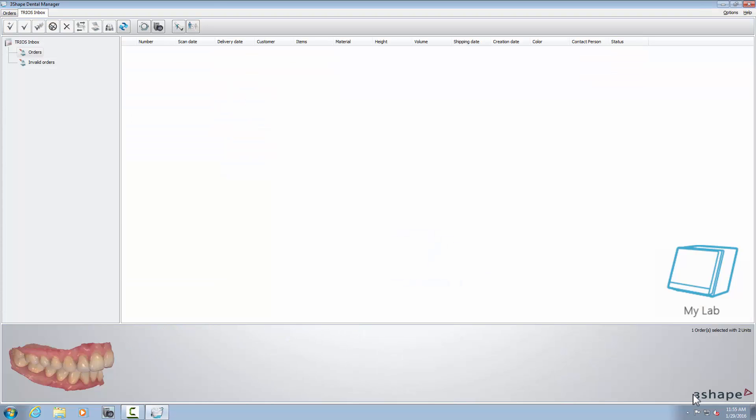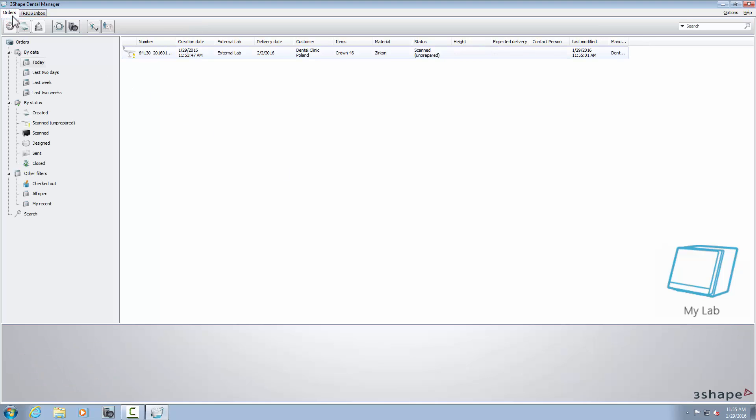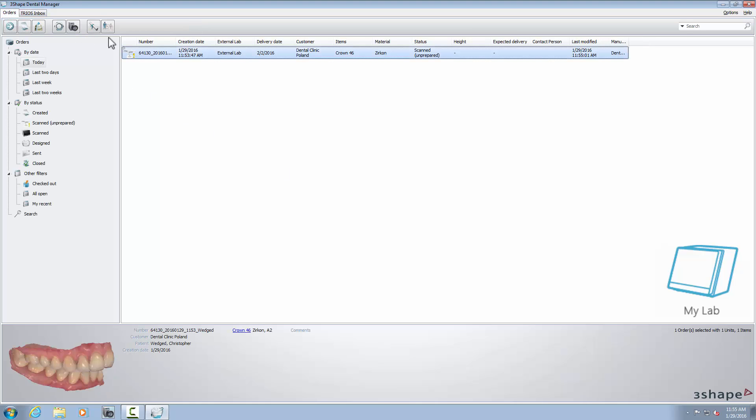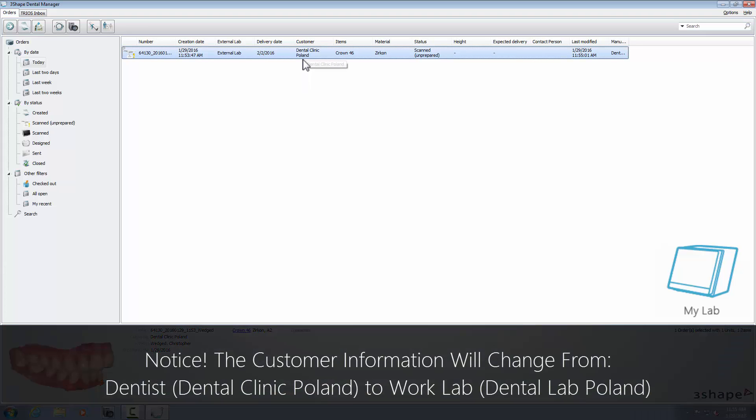The order has been set in the Dental Manager. From here, you can decide either to start designing, save it, and send it to an external lab, or just send it directly to an external lab so they can proceed with the design and/or production.